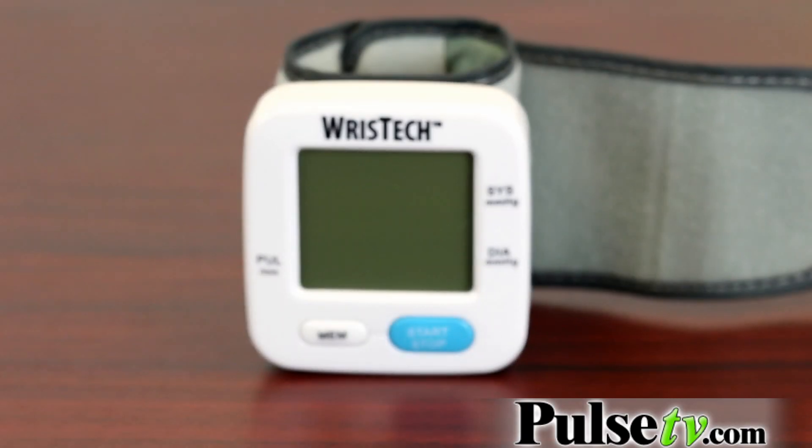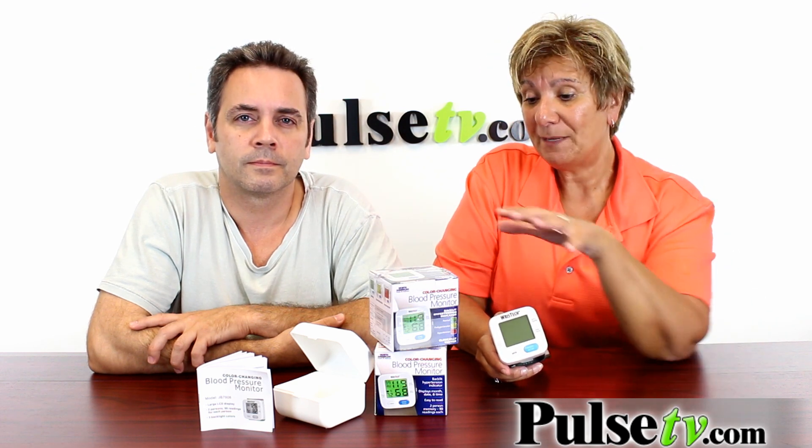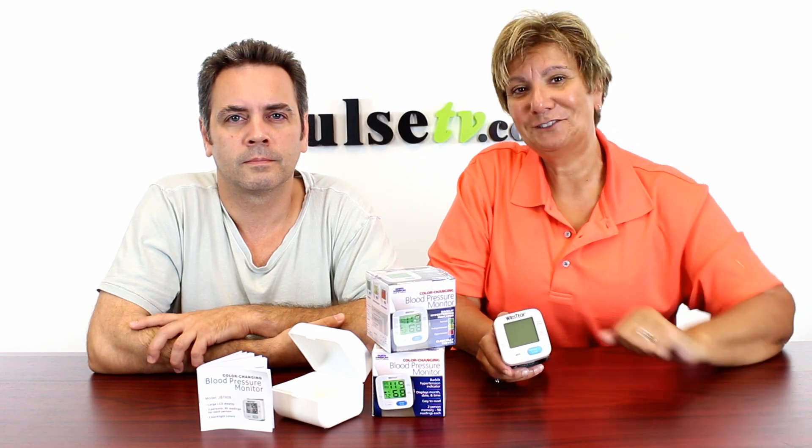You can store up to 180 readings — former readings — and that's for two people, so it's really 90 per person. But the best feature of all is our super low price. I've seen these selling for as much as $80, and they don't even have the features that this one does, so grab one of these today at PulseTV.com.